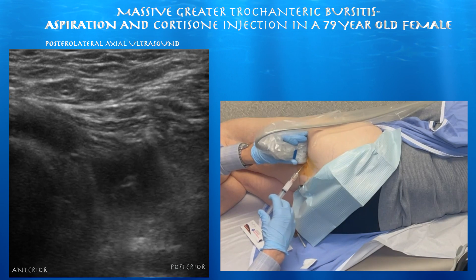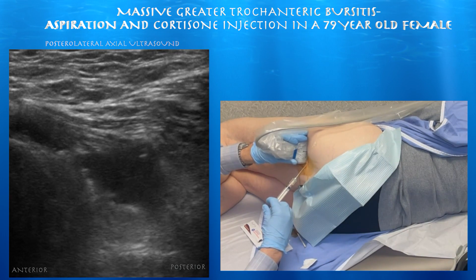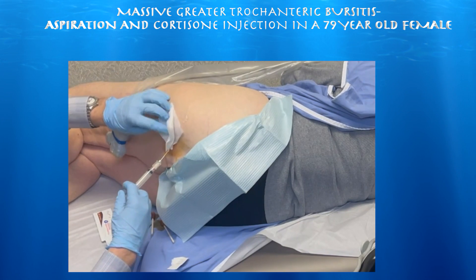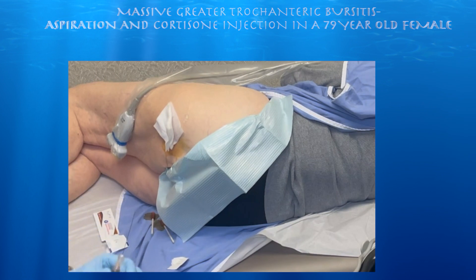Here we're starting the injection. You can see hyperechoic foci, which is essentially air within the injectate, traveling throughout the bursa. Now we're pulling out, and you can see the needle is a little bit bent upwards as we angle the needle slightly anteriorly during this procedure.